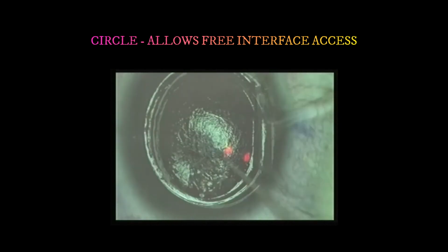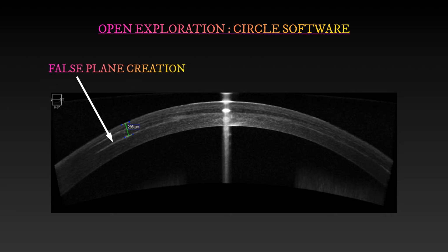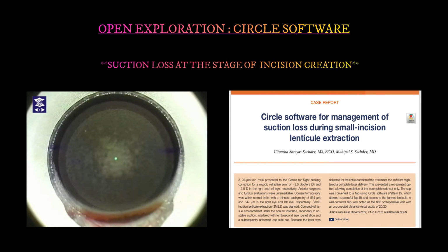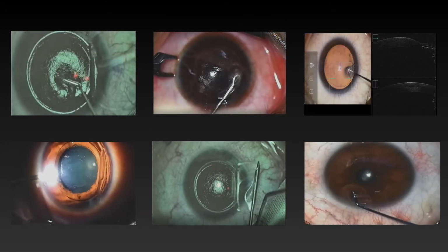Open exploration using Circle software is reserved for the following complex SMILE scenarios: lenticule retained due to creation of a false plane, multiple entry planes seen on ASOCT, suspected cases of retained lenticular bits where the ASOCT is not conclusive, and in cases of suction loss occurring at the incision stage of lenticule creation. Let us look at some of these complex case scenarios and their management strategies.